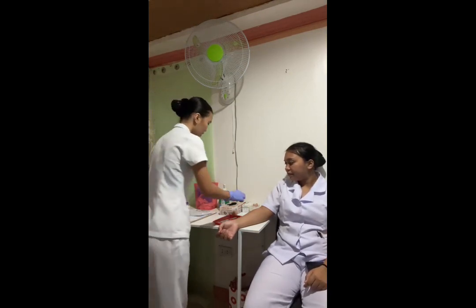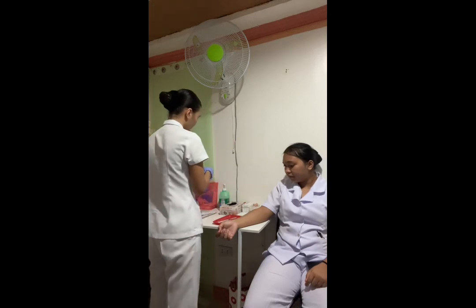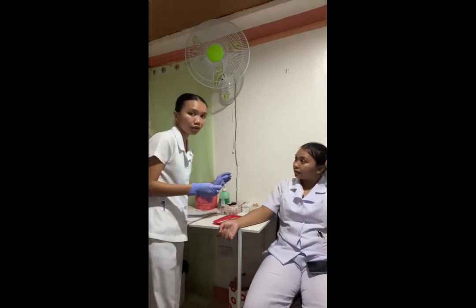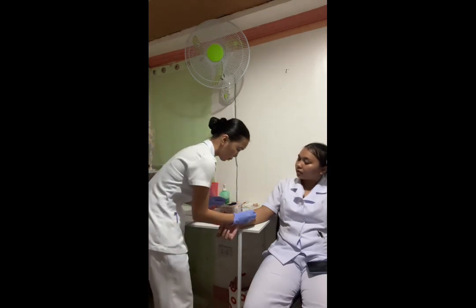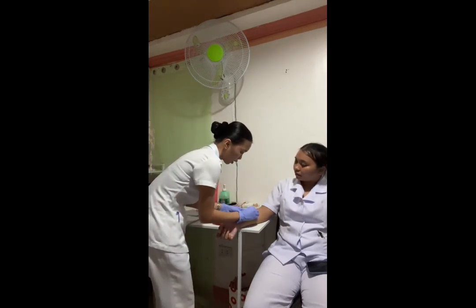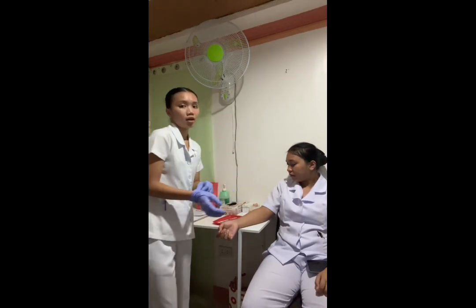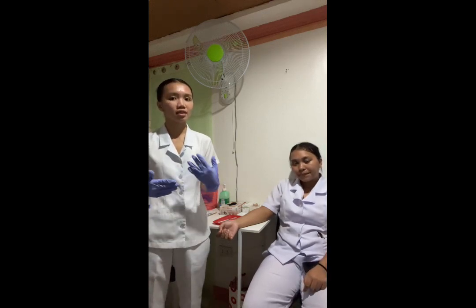And then we have to cleanse the site with an alcohol swab from the center and into the outer in a circular motion. And then discard. And then afterwards, we are going to prepare the syringe for the injection. First, we are going to remove the needle cap while waiting for the antiseptic to dry, because alcohol gives full play to disinfect after dried.